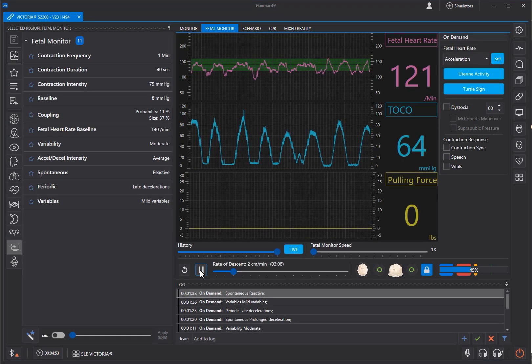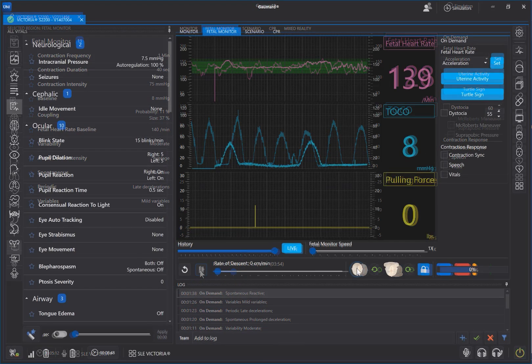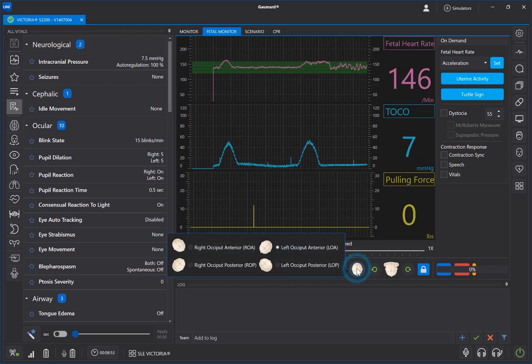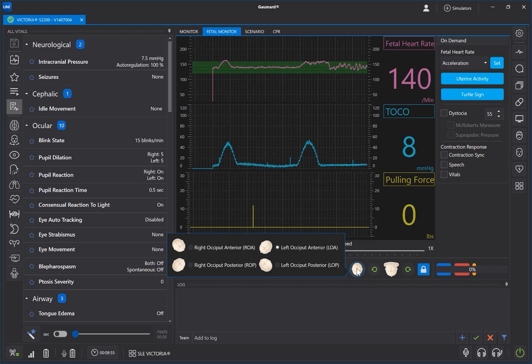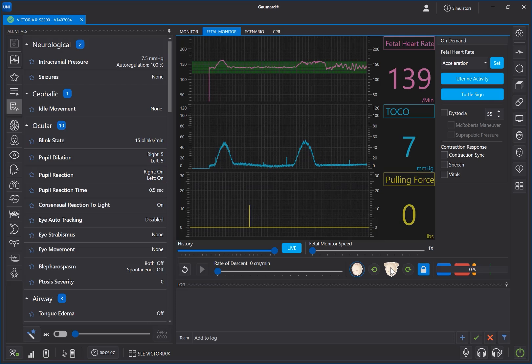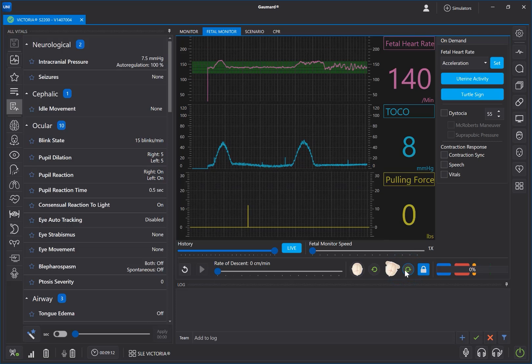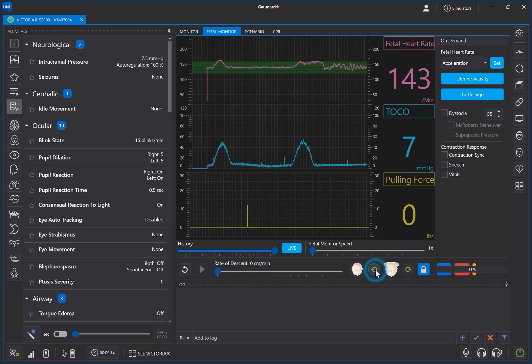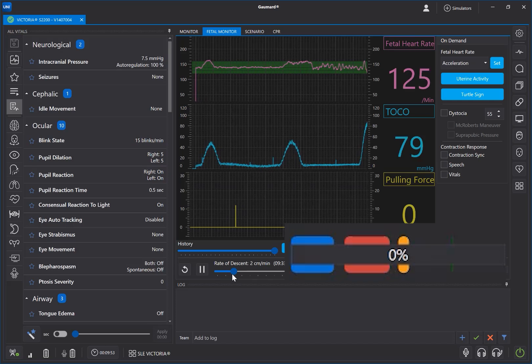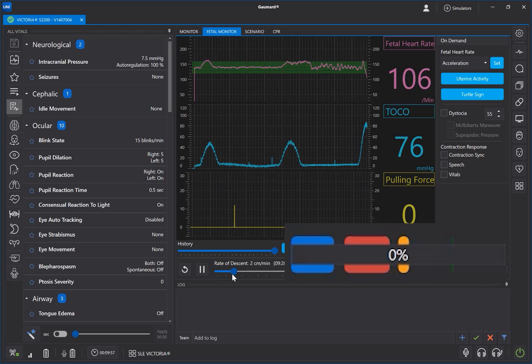Click Pause to interrupt the labor and Play to resume progress. Click the icon of the head to set the desired position of the fetus at the time of delivery. The software will automatically track the cardinal movements. To create more rotations, just click the green arrows. The blue, red, and yellow regions on the labor progress bar mark where the fetus is performing internal rotation, external rotation, and head extension.